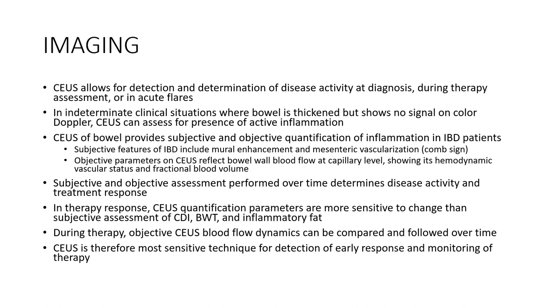in inflammatory bowel disease patients. Subjective features in inflammatory bowel disease include mural enhancement and mesenteric vascularization. Objective parameters for contrast enhanced ultrasound reflect bowel wall blood flow at the capillary level, so its hemodynamic, vascular status and fractional volume. Subjective and objective assessment performed over time can determine disease activity and treatment response.